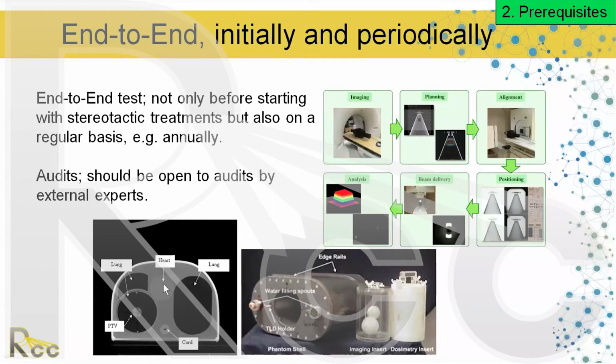And you should also rely on, or if you can, use audits. I'm a big fan of audits. In the States, we have IROC, which is out of MD Anderson, and they credential for clinical trials. I know that there are other institutions that do credentialing for clinical trials. So they're ensuring a baseline level of quality so that data for the clinical trial is valid.